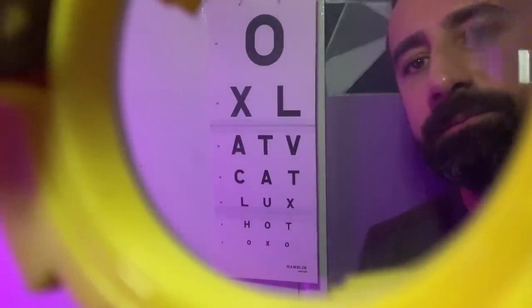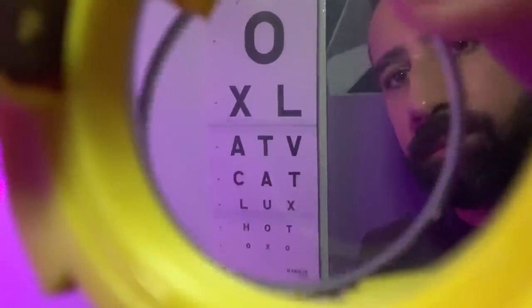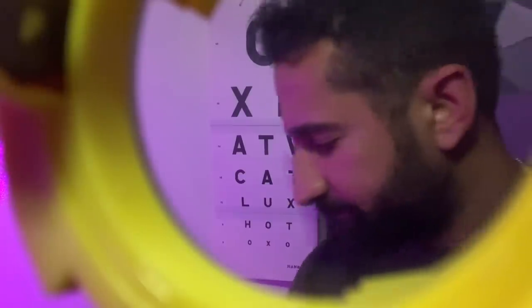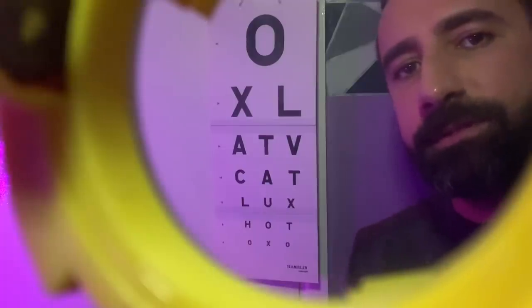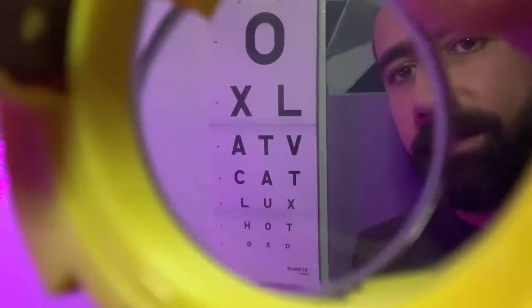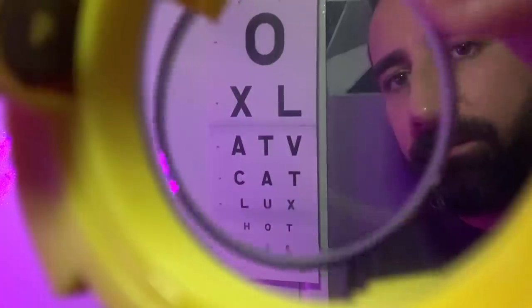with the plus lens. Okay, now this should be a little bit worse. So is the vision a little bit more blurry with compared to without? Slightly without, excellent. That's what we wanted. This is a very fine plus 0.25 diopter sphere. Should be a little bit worse in theory. But let's see. Is the smallest row you see clearer with the lens or without? With or without. Maybe slightly with.